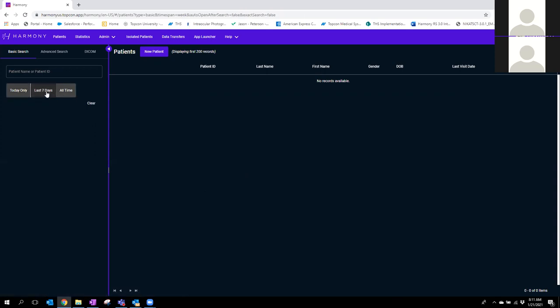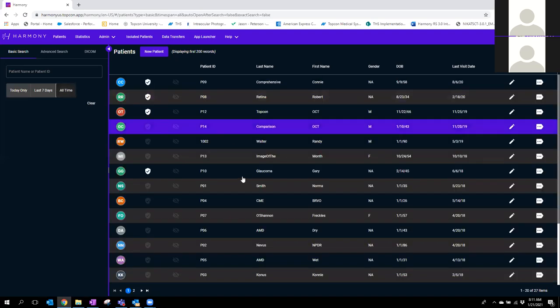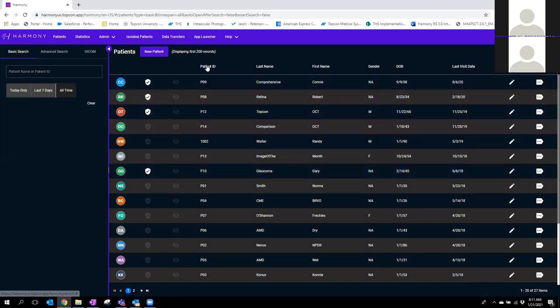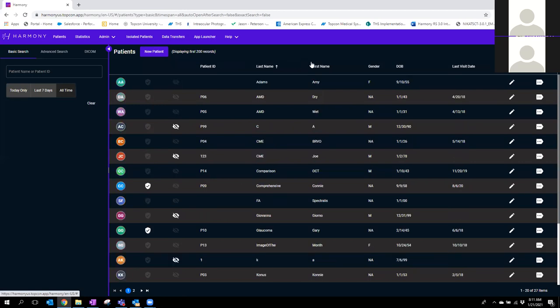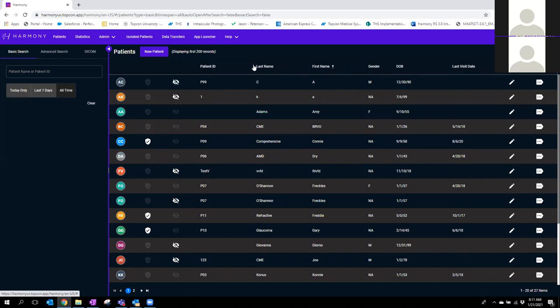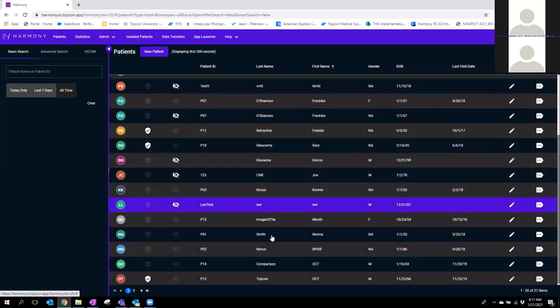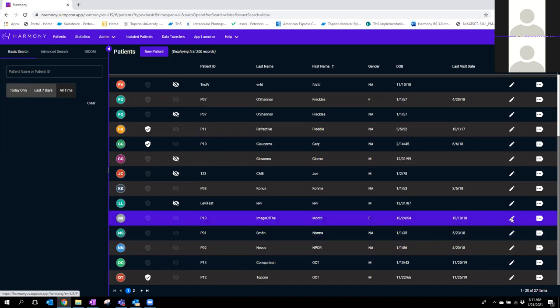You can change the time segment to like the last seven days. If you do see a list like this, it organizes patients by patient ID. You can click for ascending or descending order, or sort by last name or first name — pretty much any of these fields in the top header can be sorted. The colors here have no significance other than as a visual separator. It's pulling the patient's initials and making a logo out of it so you can differentiate one from the next. There is a pencil icon where you have the ability to edit patient demographics.